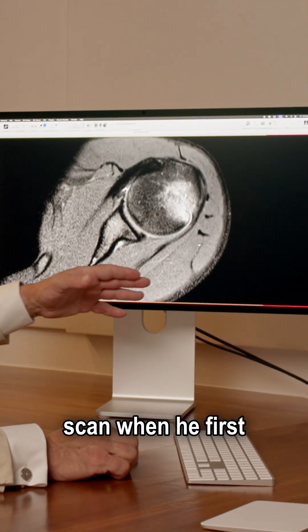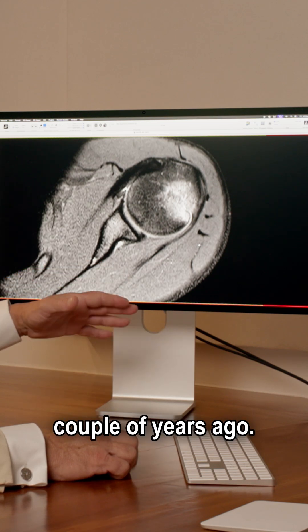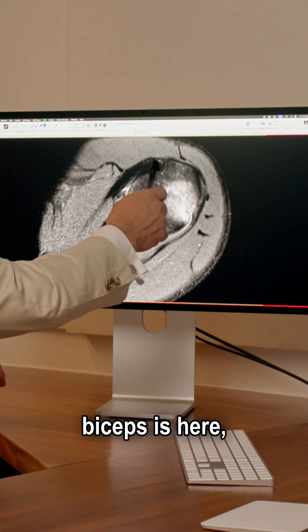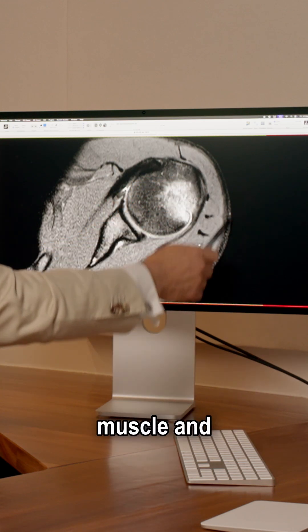This is the MRI scan when he first dislocated his shoulder a couple of years ago. This is the rotator cuff at the back. This is the back of the shoulder, rotator cuff at the front, biceps is here. You see the deltoid muscle then skin.